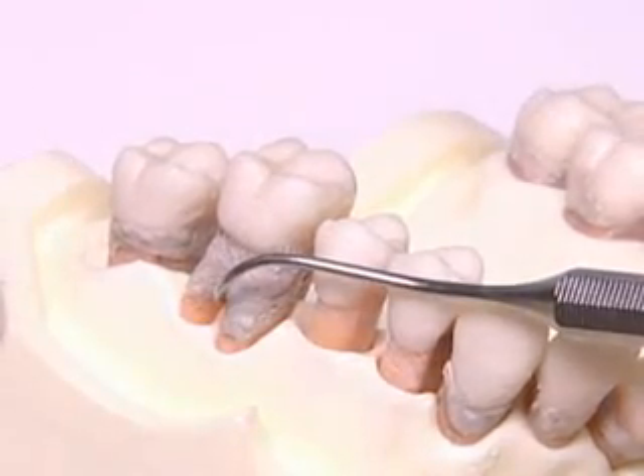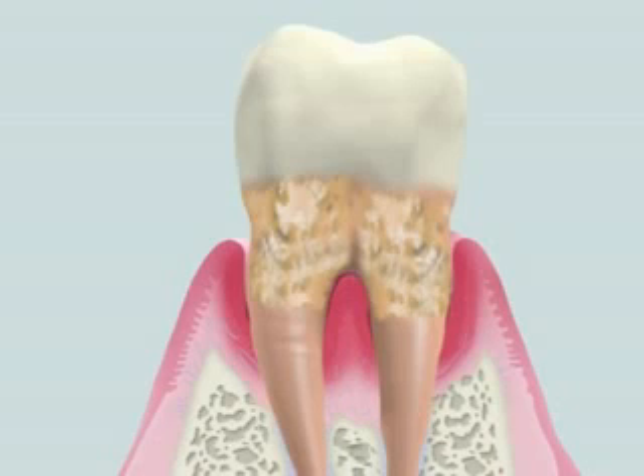First, a furcation probe is used to measure the depth. Simultaneously, root morphology and conditions of calculus formation should be examined. Probing indicates that calculus is accumulated on the tooth surface.